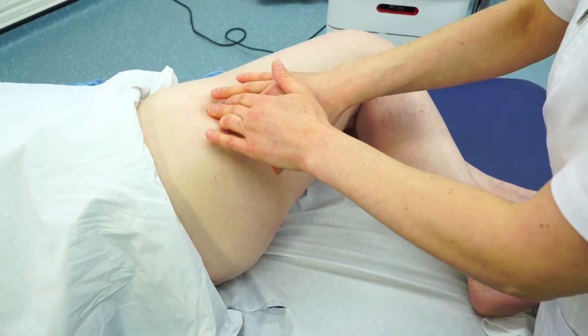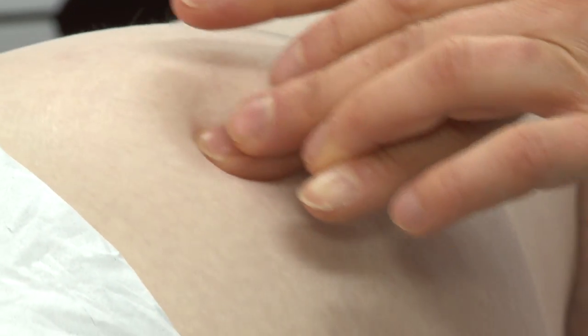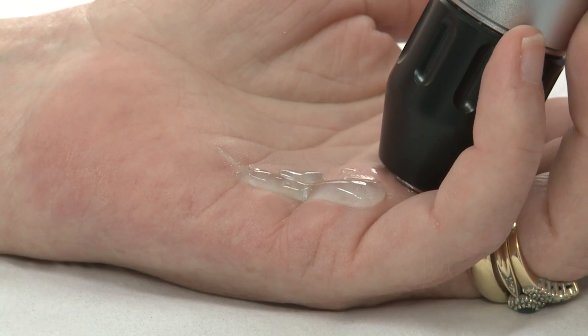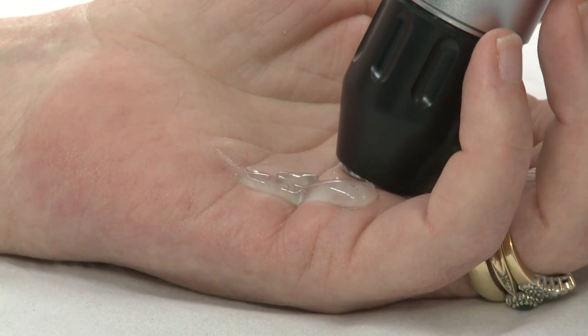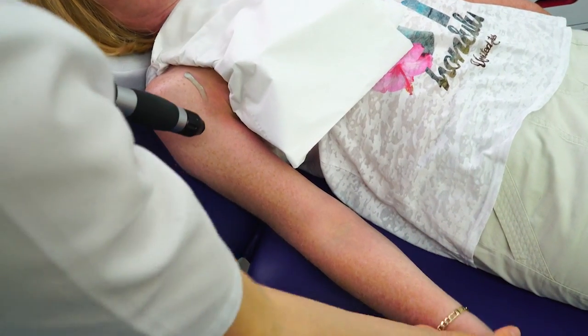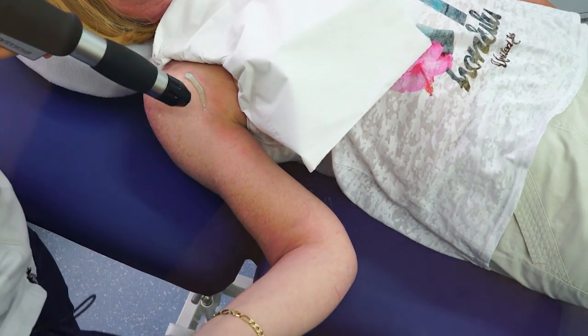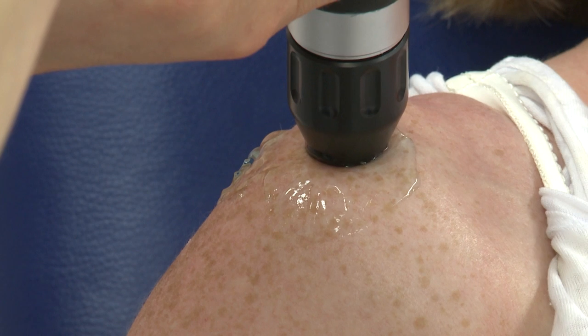As the tissue is broken down by the shockwave, the body starts rebuilding new tissue, replicating the body's own self-healing process. A consultation takes place before treatment to determine the type and severity of condition or injury. A course of extracorporeal shockwave therapy usually involves three to six sessions, each session taking about 15 minutes.